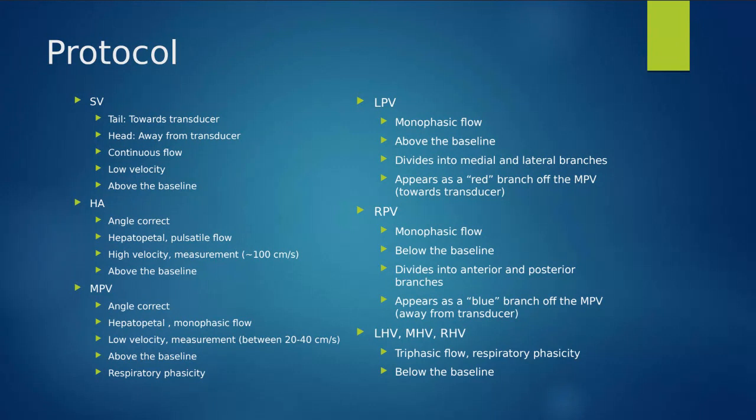Our flow is coming in here. It's getting blocked, right? For whatever reason is causing the hypertension, the resistance. So we put a shunt for the blood flow to go directly from the portal system right into the venous system out. So that's how we can relieve some of that pressure buildup in the liver.